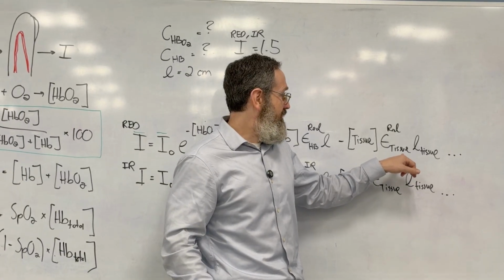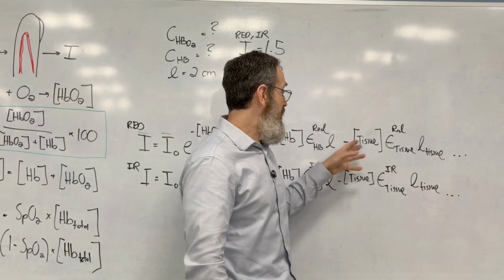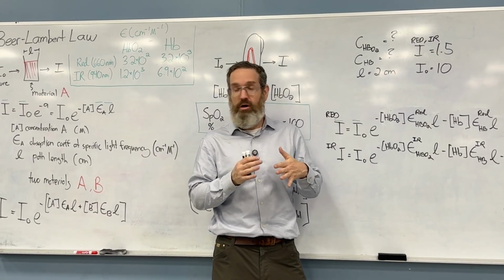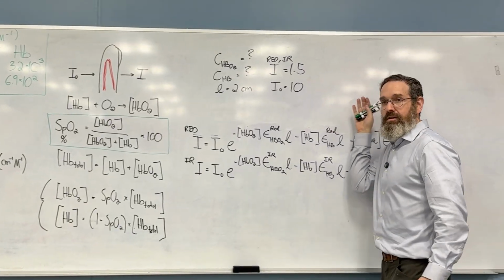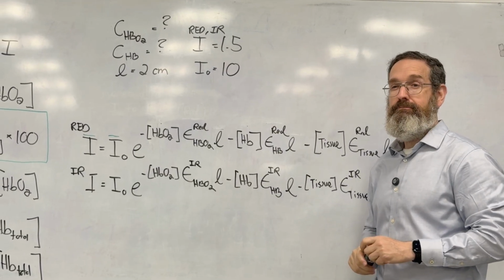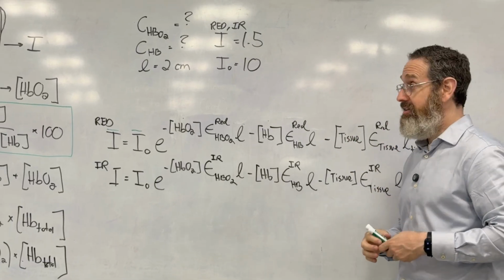So, unknowns upon unknowns. You have an equation. So I can't solve this problem. Do you understand why? We almost had it. We're just there. We're about to reach it, and then we can't do pulse oximetry unless I draw blood out. Okay, but there's a solution. And it's a very elegant solution.